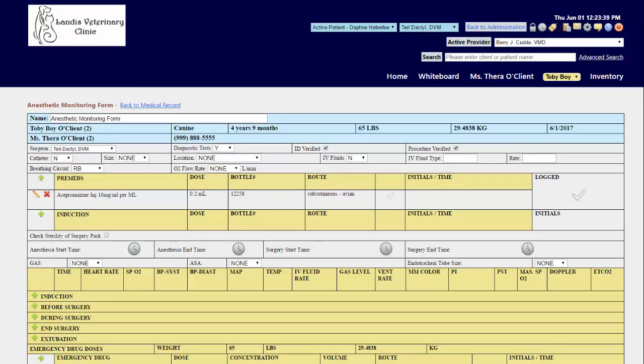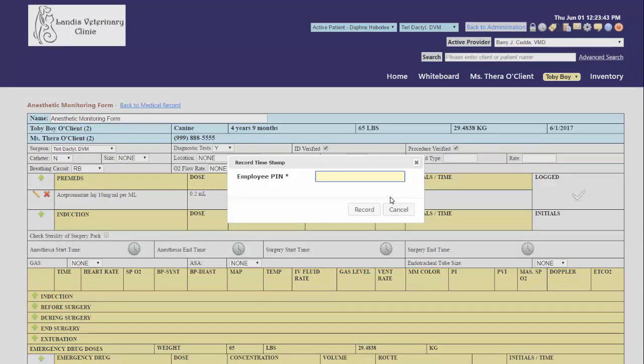Once you have given a drug, click on the check mark. It will prompt you to enter in your employee PIN number, and then click the record mark that you are the one giving this drug.